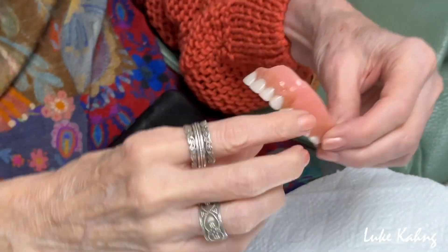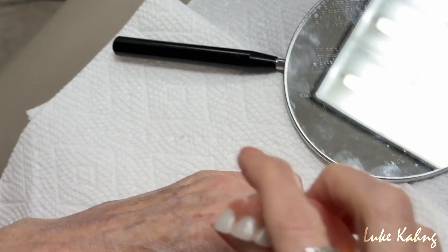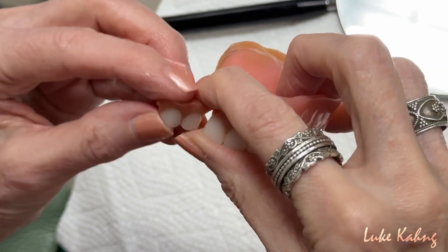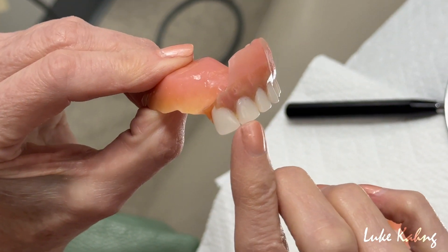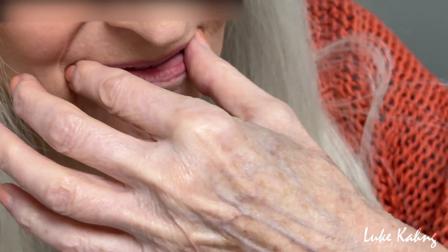Like my old denture was just a little — I don't know if I can get all these pieces together. I'll try. I don't need the other side. Okay. But anyway, just so it's like — see how these — just more curvature from your teeth. I see. So even though it's straight, make a little bit U-shaped. Not so — it's too — it feels like it's too pointy in the front like this.